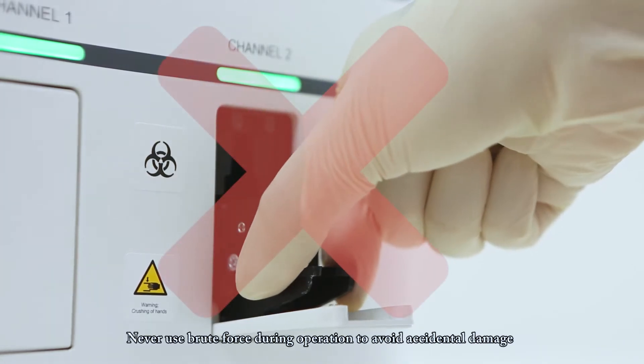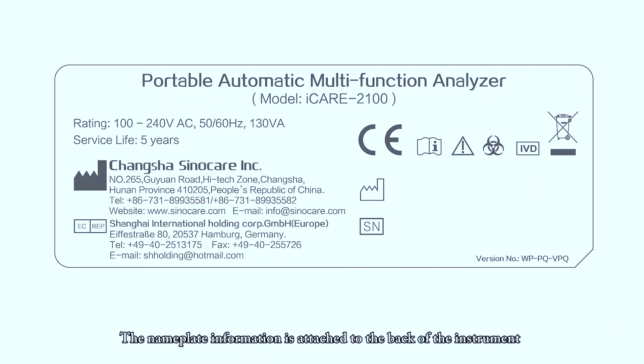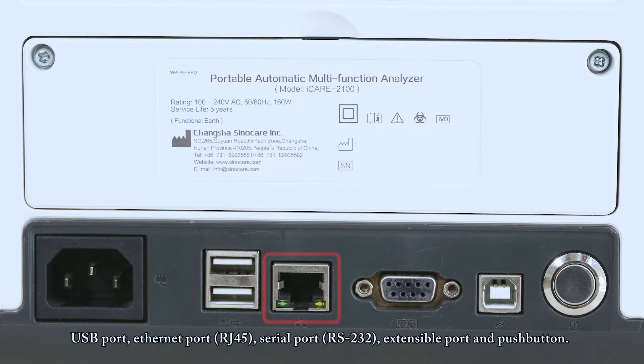Never use brute force during operation to avoid accidental damage. The nameplate information is attached to the back of the instrument, including manufacturer information, production date, after-sales service telephone, electrical safety information, and serial number. Below the nameplate are various ports. From left to right: power port, USB port, Ethernet port, serial port, extensible port, and push button.